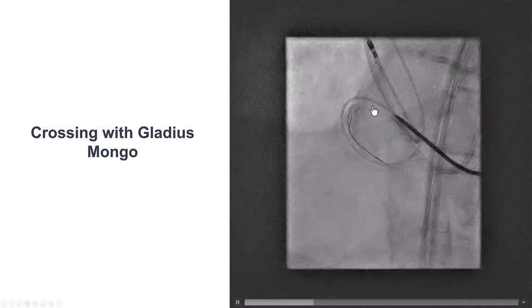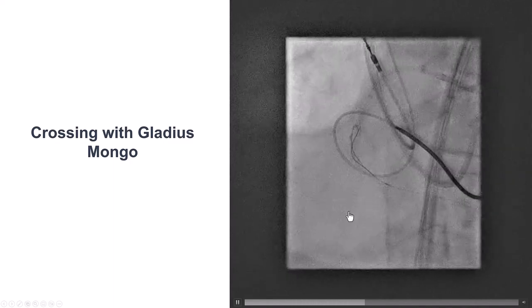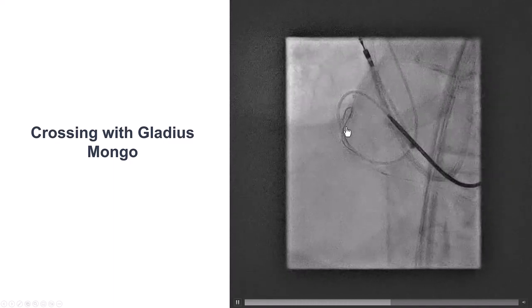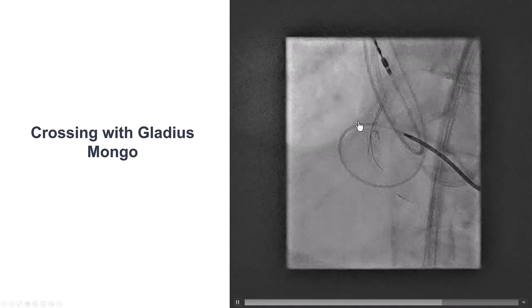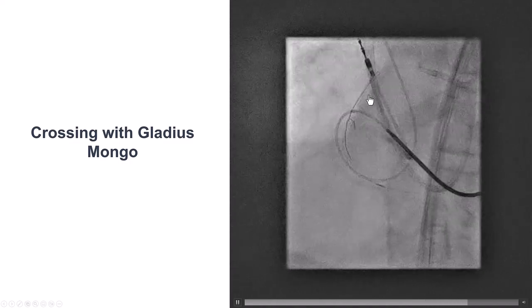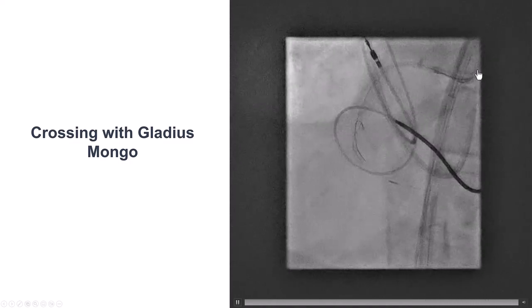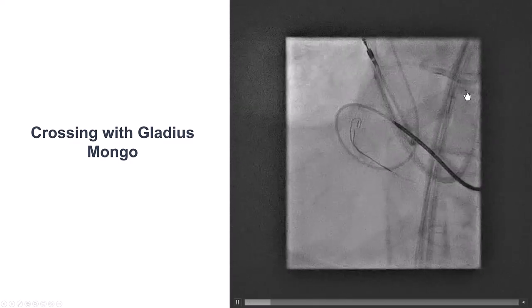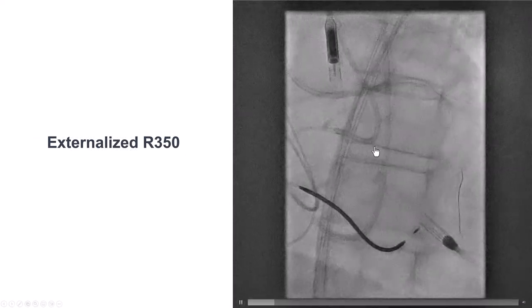The way to solve this is to use larger balloons to create a dissection in the proximal part of the vessel that can connect with the retrograde guide wire. After doing this with increasingly larger balloons, we were eventually able to advance the retrograde Gladius Mongo all the way into the guide extension and into the antegrade guide catheter.